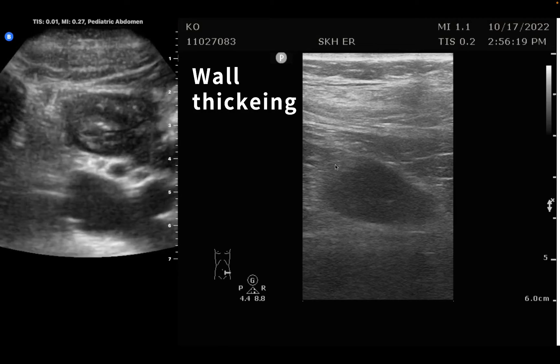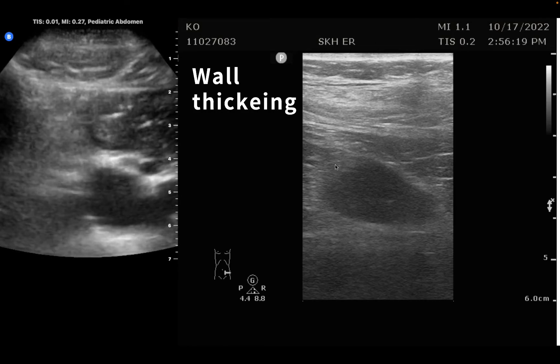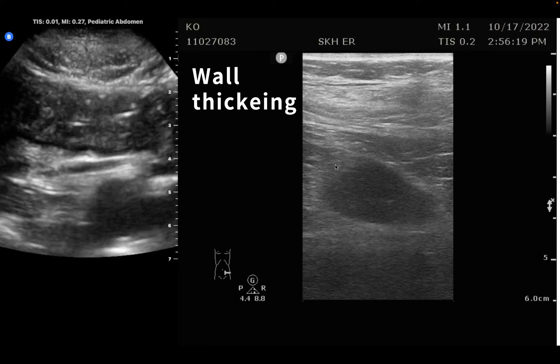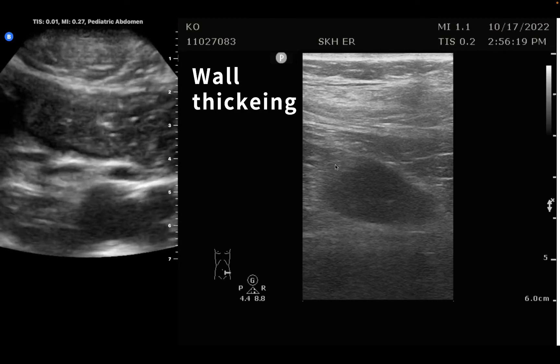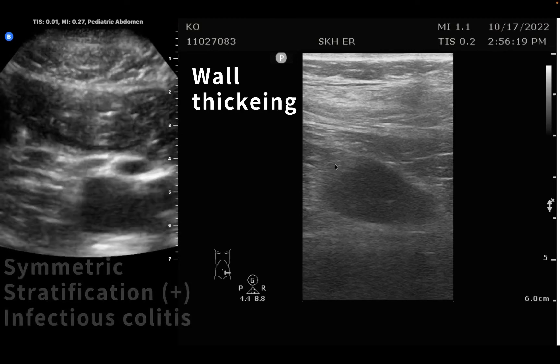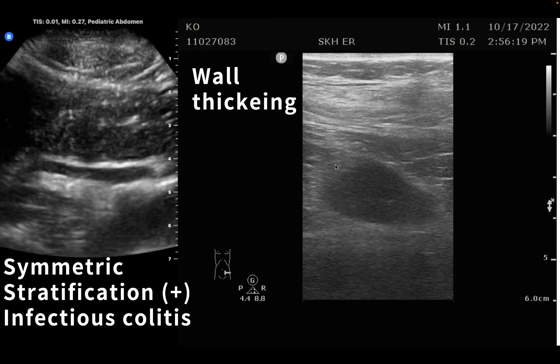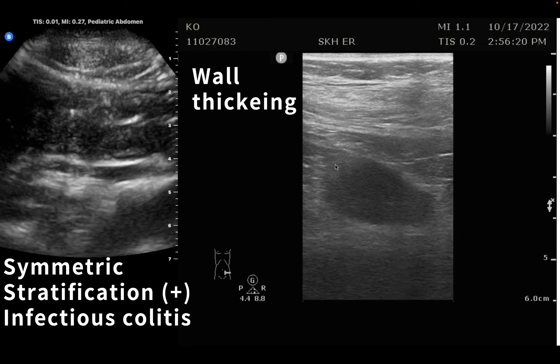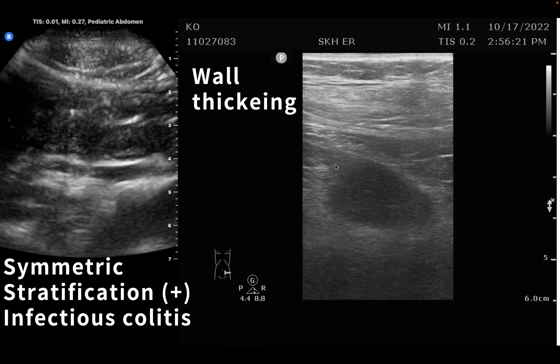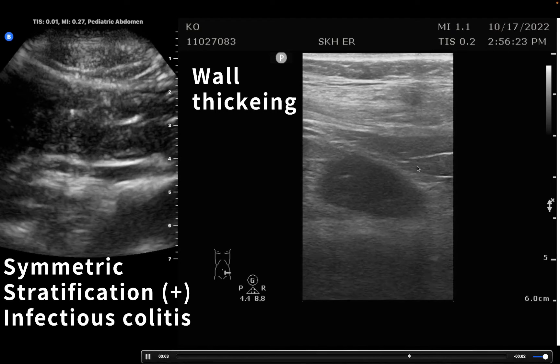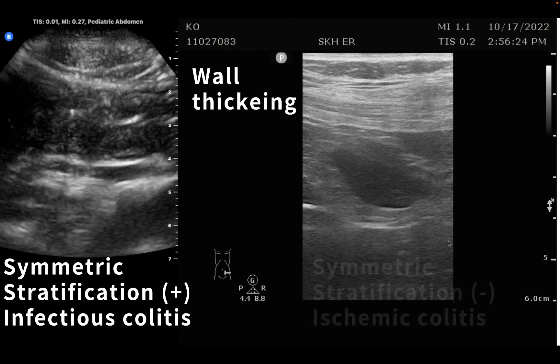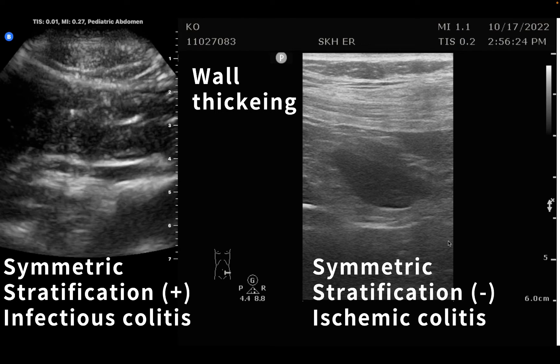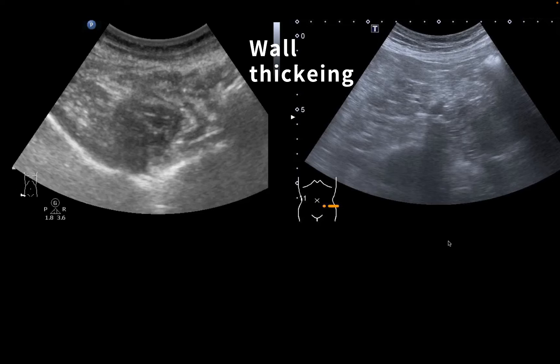Let's take these two videos as comparison. Video one is from myself — when I was recording this, I happened to have infectious enterocolitis. So it's my transverse colon: swollen, symmetric, with preserved stratification. The other patient's descending colon has a wall thickened without adequate stratification. This is a symmetric loss of stratification from a patient having ischemic colitis.